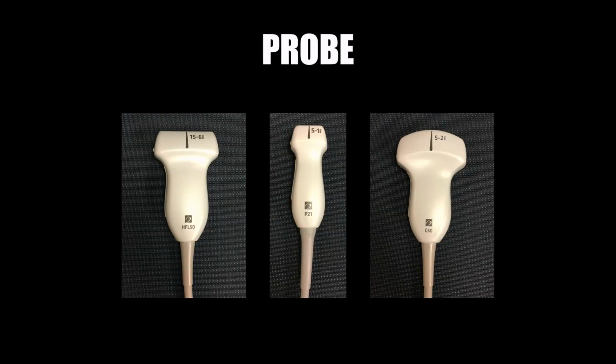Your probe of choice for this exam is going to be the linear probe. You want that high-frequency probe to give you maximal resolution. You don't need a lot of depth for this. Remember, your patients are going to be 1 to 2 months old, so with the linear you're going to be able to cleanly see the full depth that you're going to need.